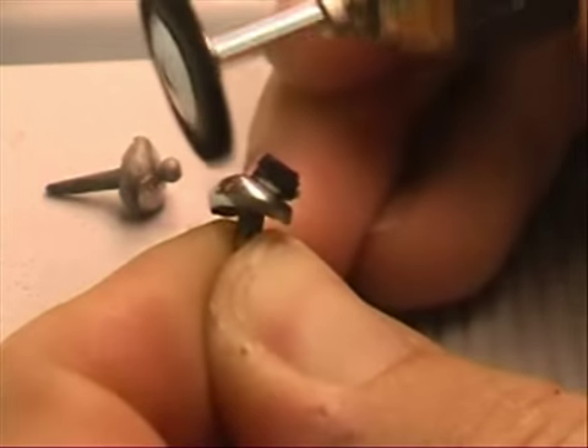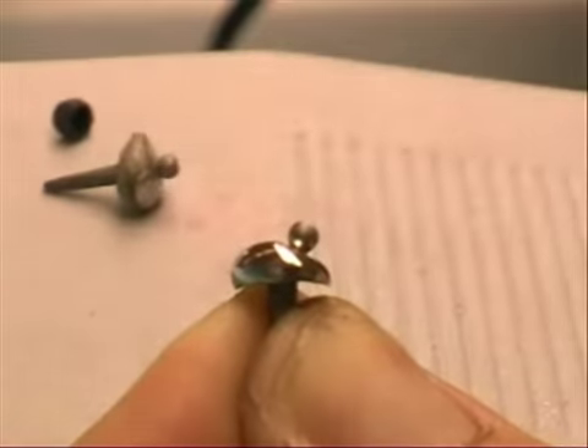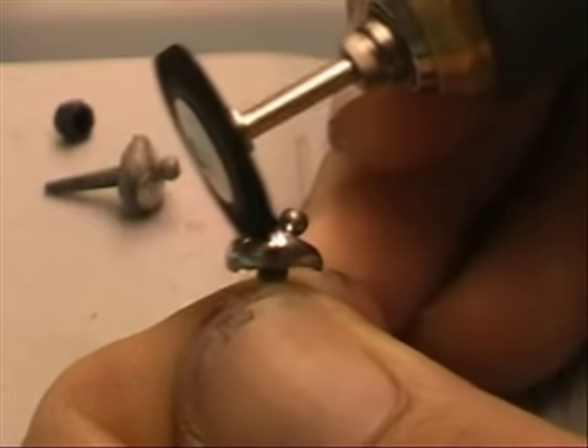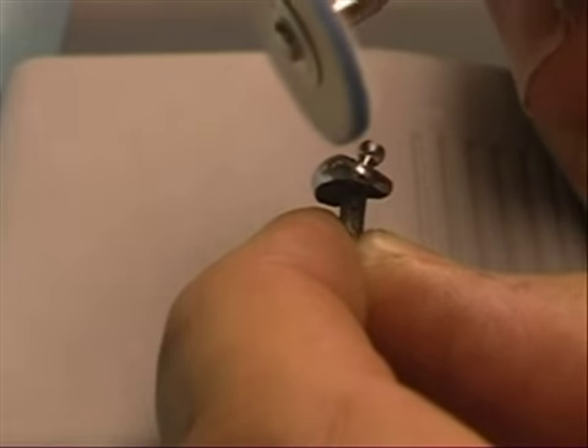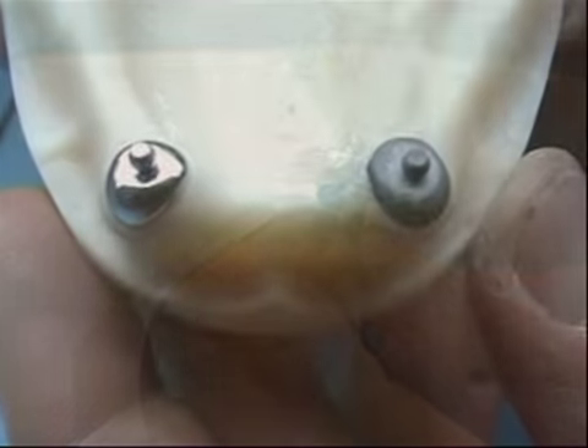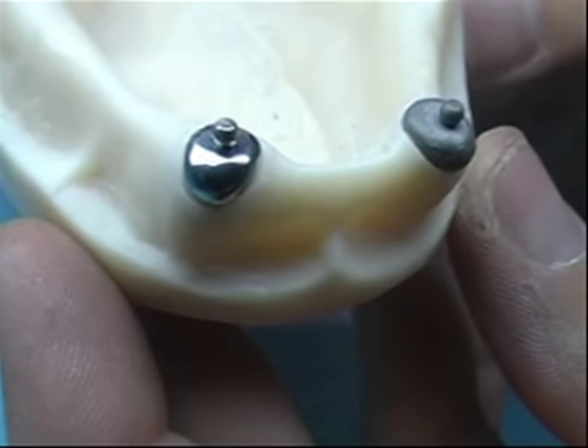Polish the cover well in order to avoid plaque receptacles. It is not necessary to polish the sphere — just lightly touch it with cotton burrs in order to smooth it up gently without wearing it out.